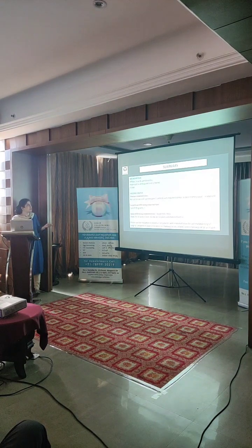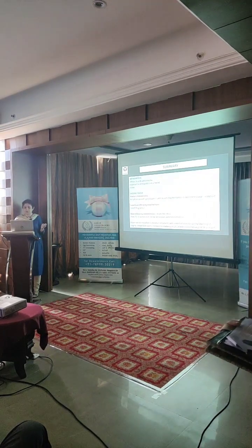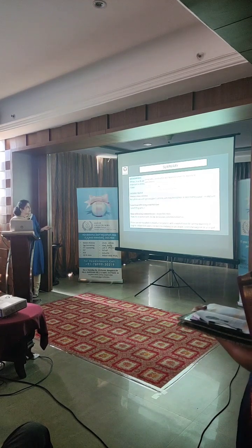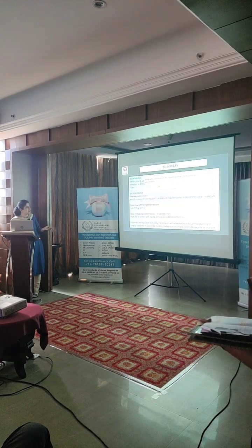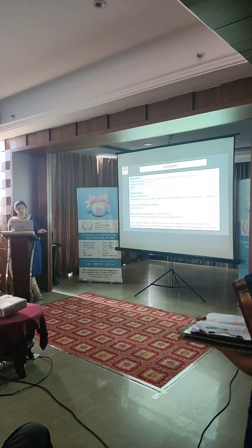So to conclude, adenomyosis of course can be diffuse, focal or you may see an adenomyoma. It's very important to be able to confidently differentiate it from a fibroid, and remember there's an entity called FOAM which is indicative of deep endometriosis. Now if you want more information, because I have only 20 minutes, you can go through this article about how you should systematically report adenomyosis. And as far as endometriosis is concerned, for ovarian endometriosis, it's important to note that not all masses with ground glass contents are endometriomas.